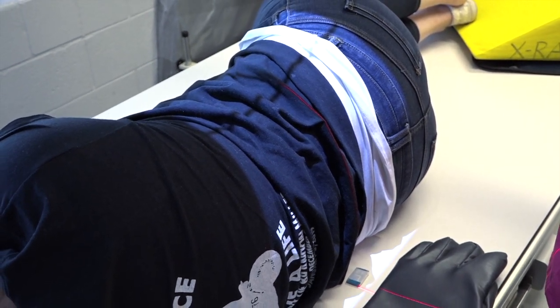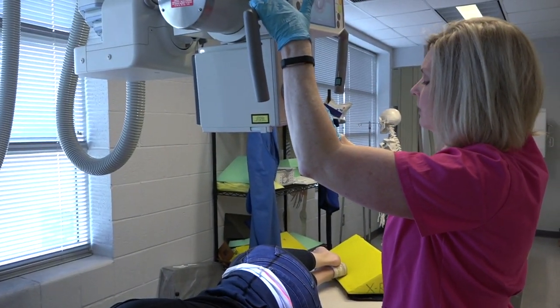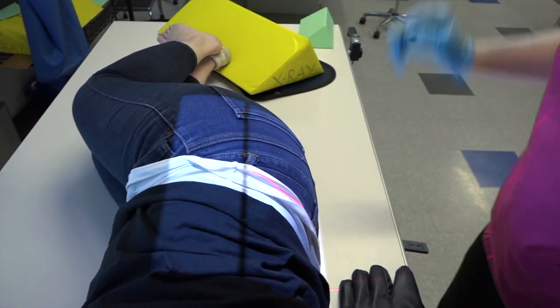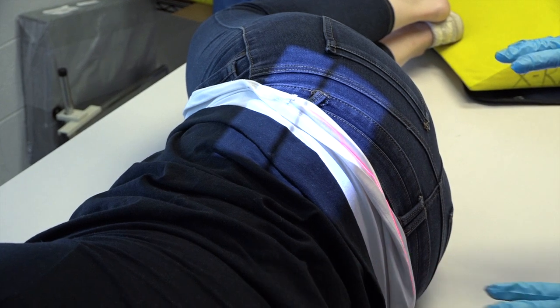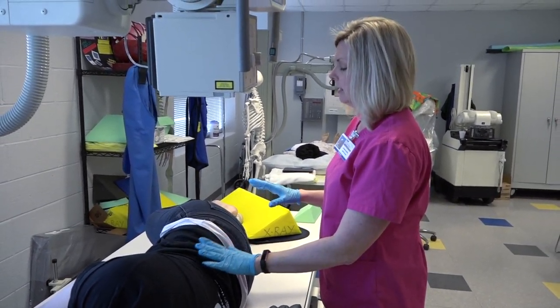So our last position is the lateral spot. We're going to angle 5 to 8 degrees. Our centering is 2 inches, a couple fingers beyond or posterior to the ASIS. Collimate. And again, we want to see this L5-S1 joint space in a lateral view. And remember, with the L-spine, we do want to ask the patient to put on a gown so we aren't showing the artifacts of their jeans and zippers.